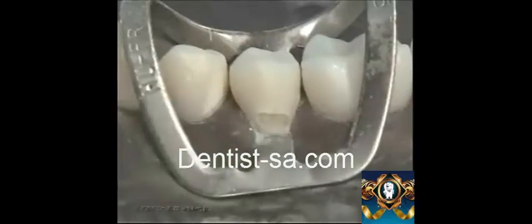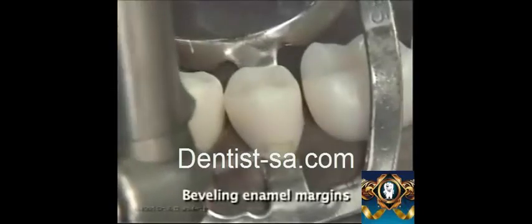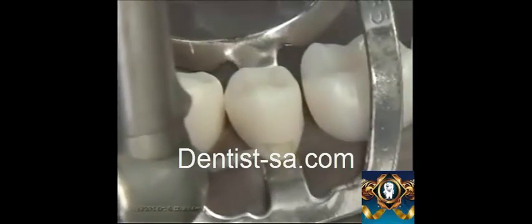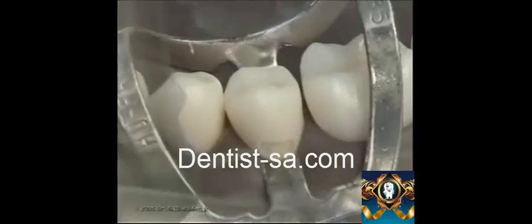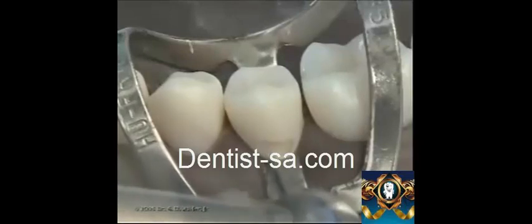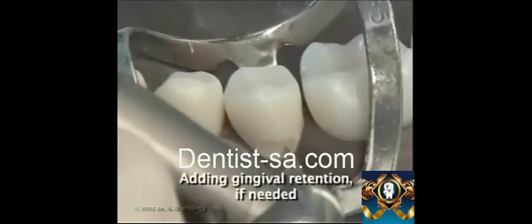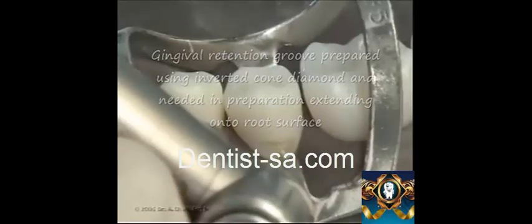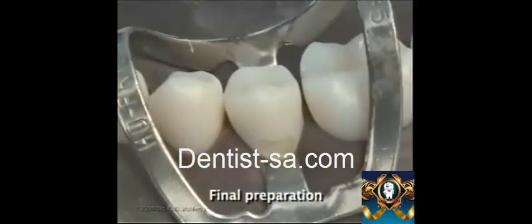The preparation is now being refined with the straight fissure diamond. All the enamel margins are beveled using a flame-shaped diamond. This beveling is contraindicated if the cavity margin is on the root surface. Beveling is continued. If required, an additional gingival retention groove could be placed on the gingivo-axial line angle, especially for cavity margins that extend onto the root surface. This is the final cavity preparation shape.